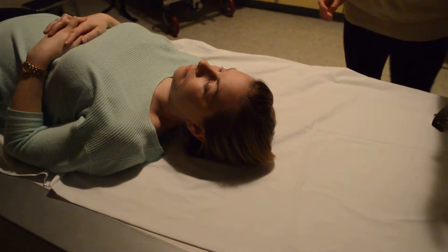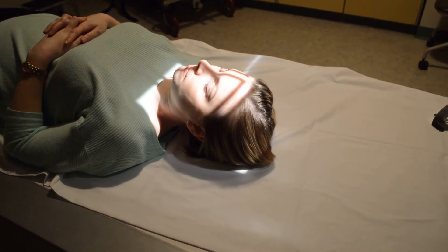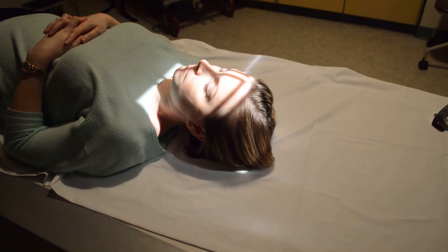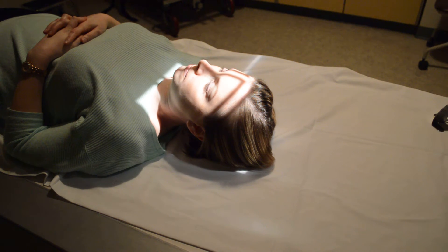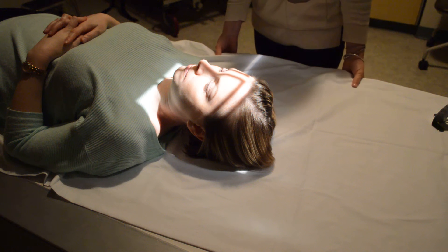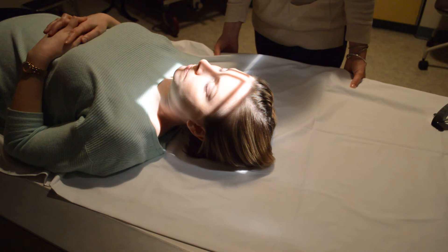You cannot adjust your patient's head for any rotation or tilt, because I do want you to treat this like a true trauma. So your patient just stays still for you.